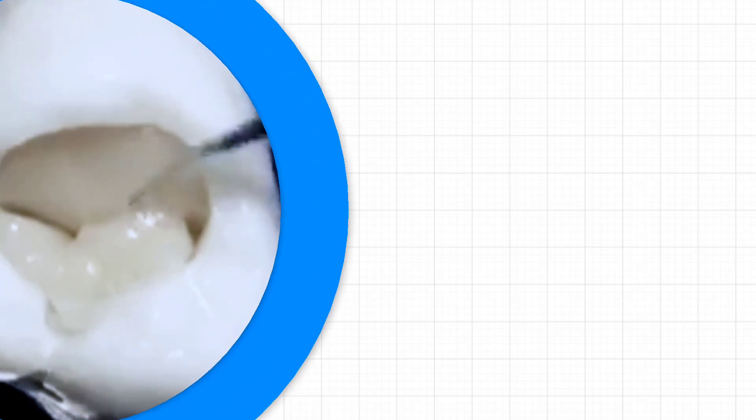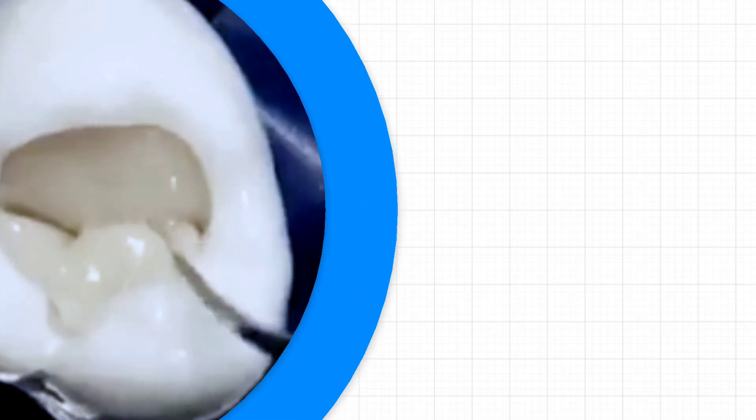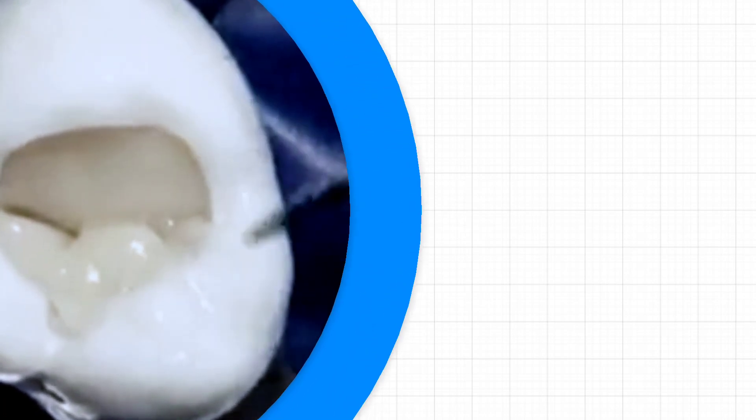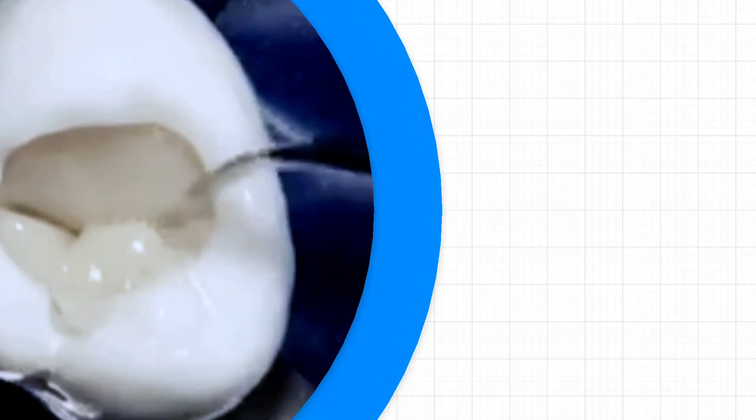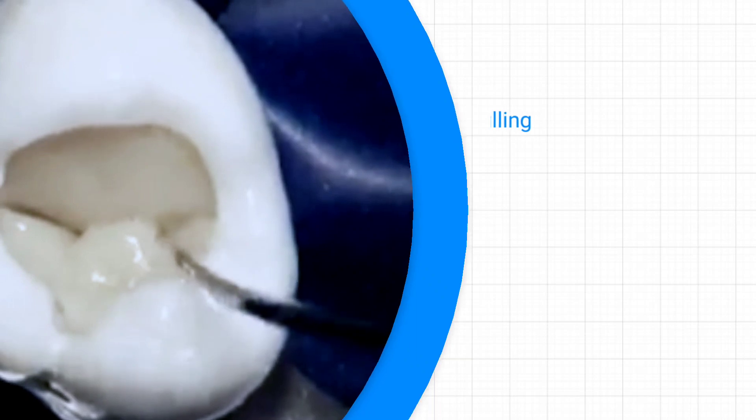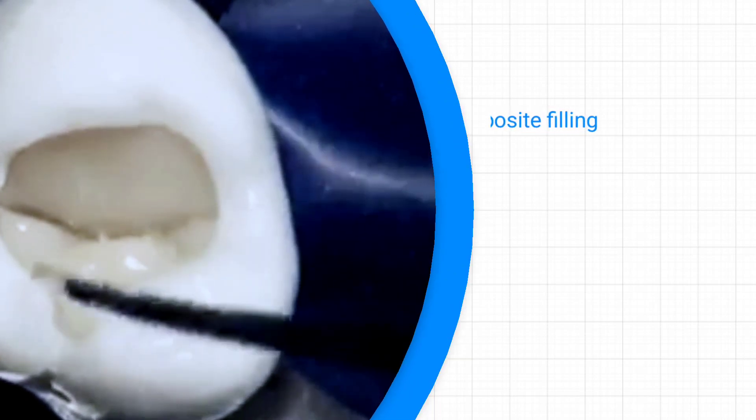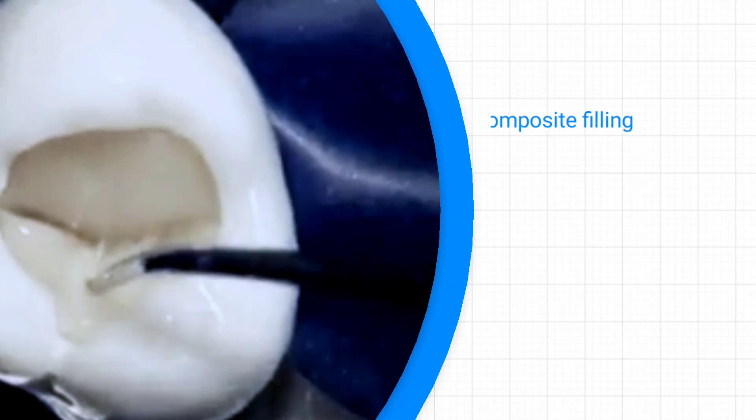One reason why we tend to place composite as multiple thin layers instead of using just a single lump is that the light from a curing light can only penetrate through so much thickness, and this thickness is around 2 millimeters at a time. If a layer is too thick, it won't get fully cured.